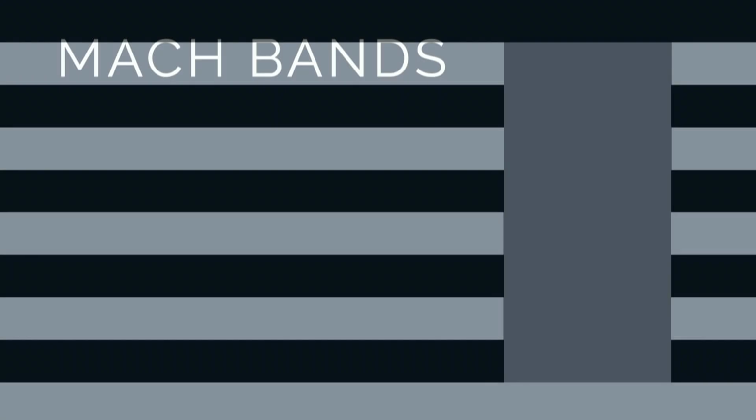But as we look at those gray rectangles, the ones against the white background versus the one against the black background, the boxes on the left look darker than the boxes on the right. But that is due to lateral inhibition, and it results in contrast misperception. If we bring these together, and I'm not doing anything fancy here, these are actually all the same color, but they look different based upon the background.